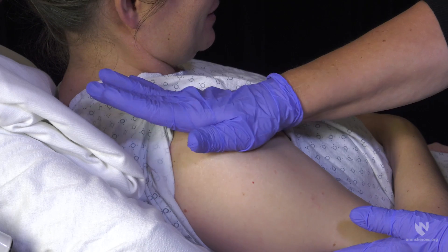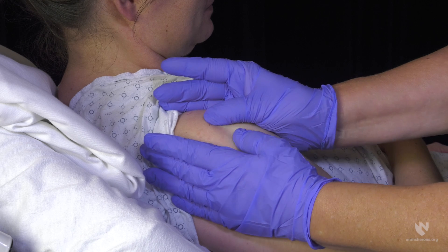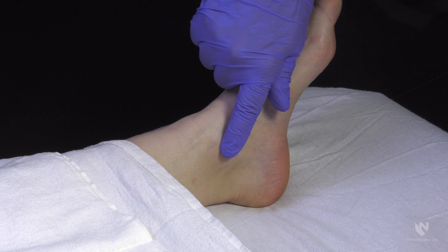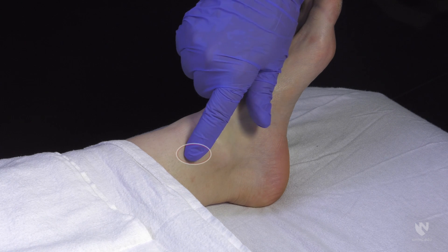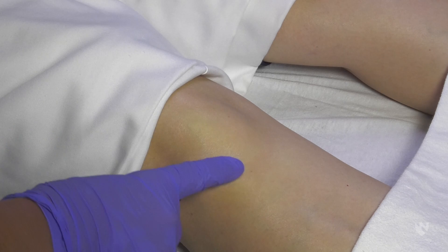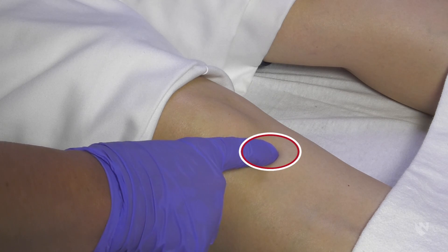Always remember to use your clinical judgment when determining the best site of insertion. Other sites that may be used for IO access include the proximal humerus and the distal tibia. For placement in the proximal humerus, feel for the surgical neck — the site will be about one centimeter above this area. For placement in the distal tibia, feel for the medial malleolus — the insertion site will be about two centimeters proximal to this point. When placing in the proximal tibia of an adult, feel for the tibial tuberosity; placement will be two finger breadths below this point.